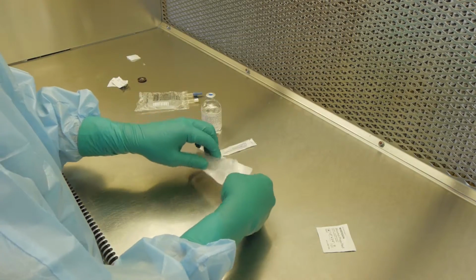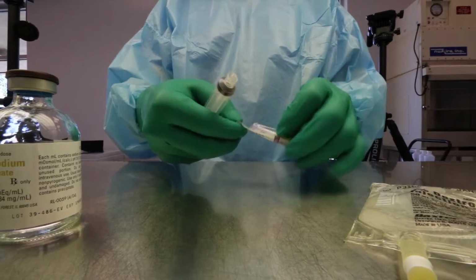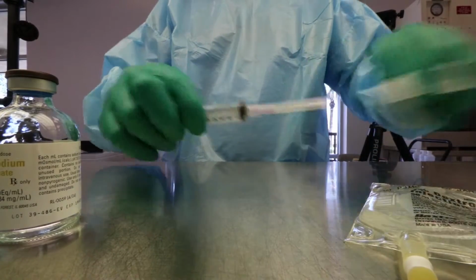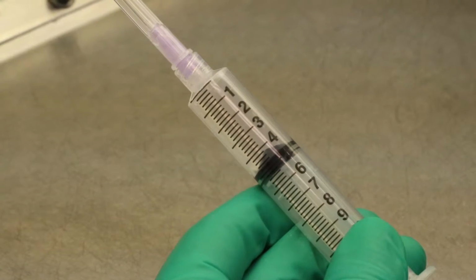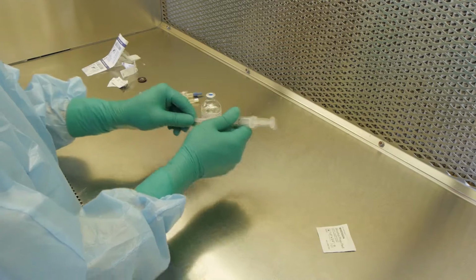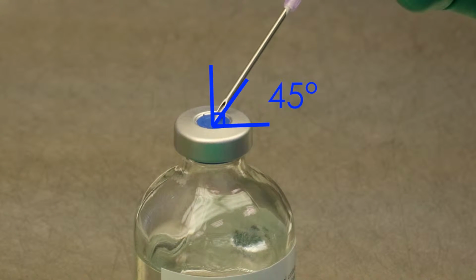Then assemble the syringe, leaving the needle cap on the needle. Pull the plunger back to fill the syringe with the same amount of air as the amount of solution you wish to draw up, in this case, 5 mL. Now that your syringe is assembled, remove the needle cap and puncture the port with the needle bevel side up at a 45-degree angle, as shown here.